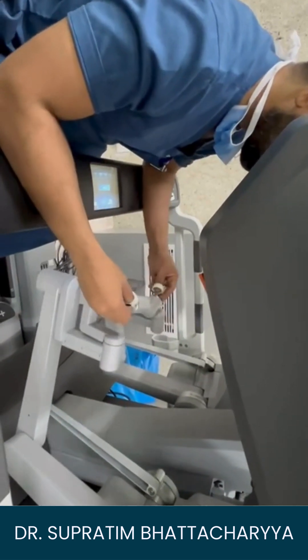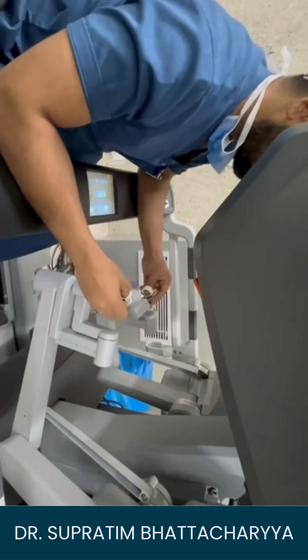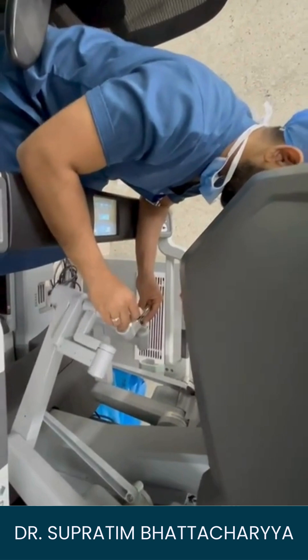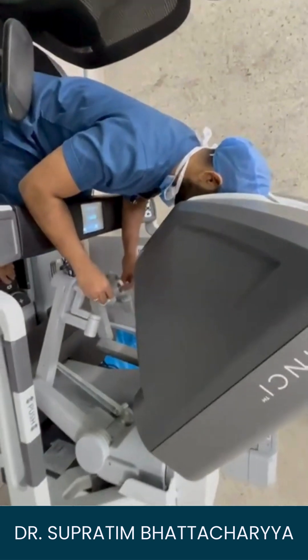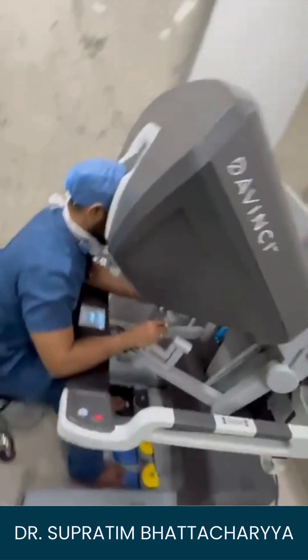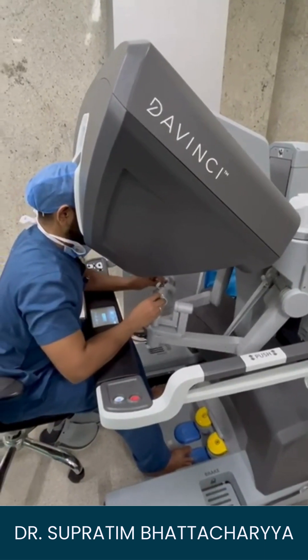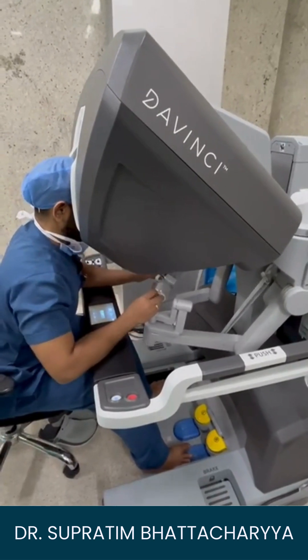We get a very magnified 3D vision from here. After seeing the operative field, we move our instruments from here, and by this we perform the robotic operative process.